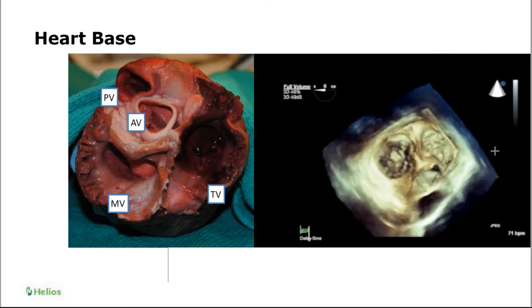Something that is definitely easier to orient is the mitral valve, because it's a smiley, right? So the commissure is open upward. So if we orient the mitral valve en face looking upward, then the other structures will come into the same surgical orientation. And in this case, when it comes to the aortic valve, you see this is the interatrial septum. That's the non-coronary cusp. The one at the top is going to be the right coronary cusp.